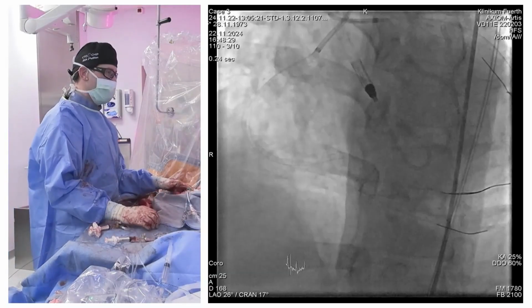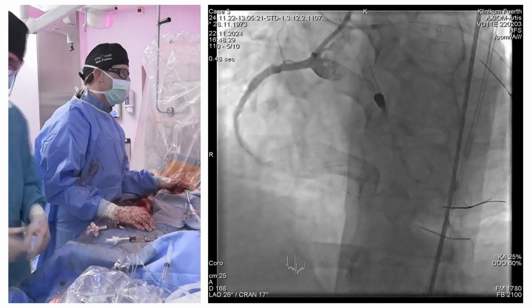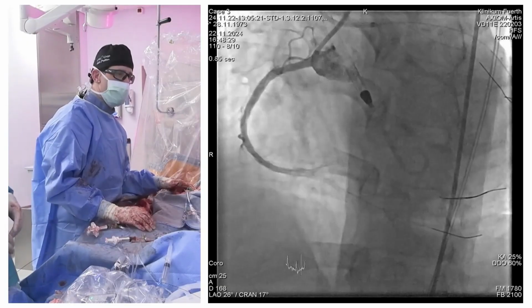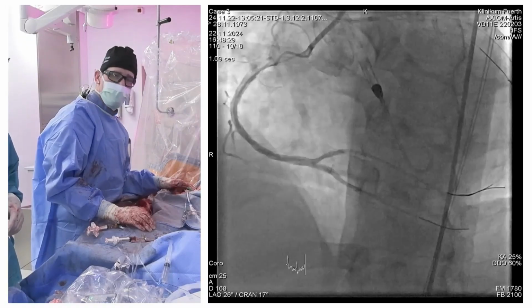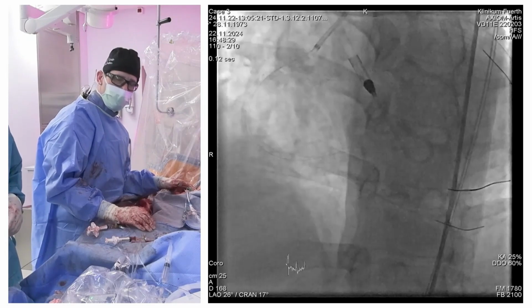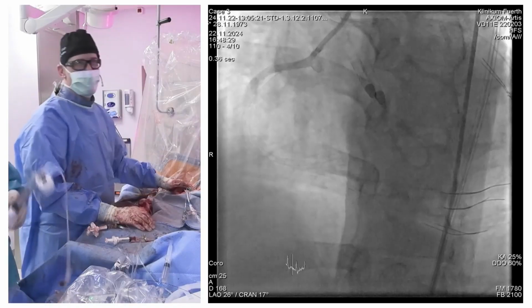It's coming back, and actually it's functioning, and then it looks completely different, and usually much better. Do you think that we always need to make a picture? This is a really old guy, the Hustler, who says that maybe we should go for a good result, not for a 100% picture that we can get at the end of the operation or procedure.